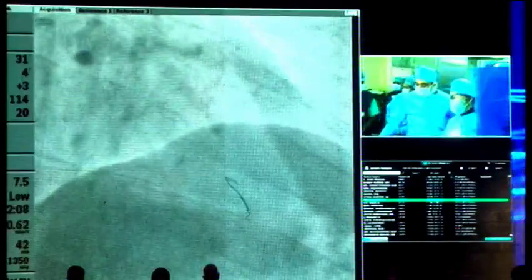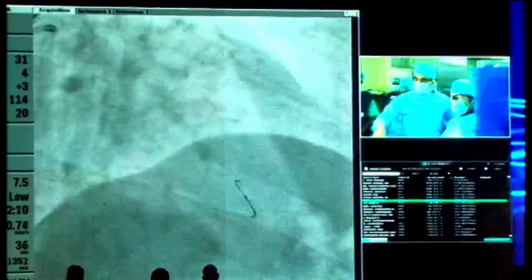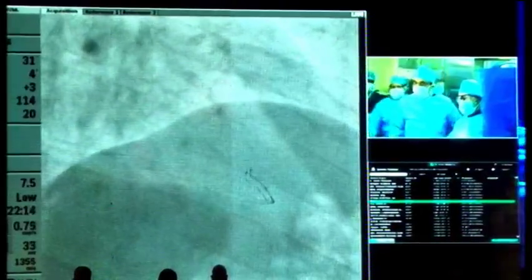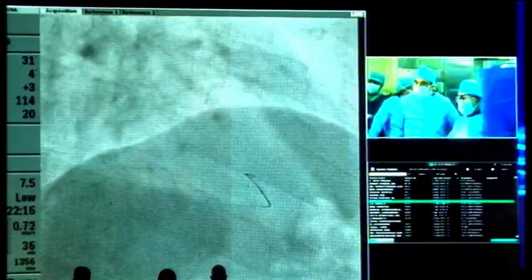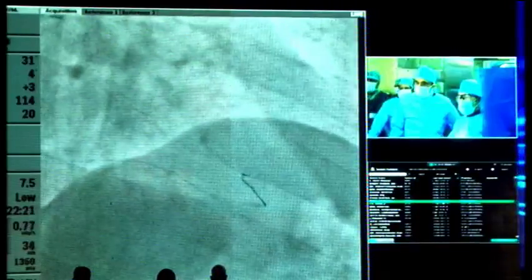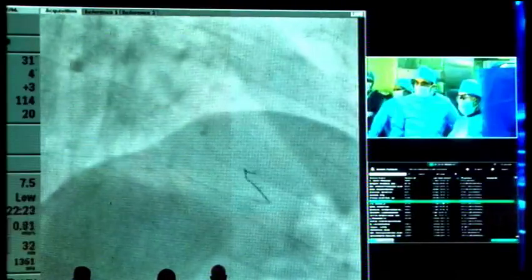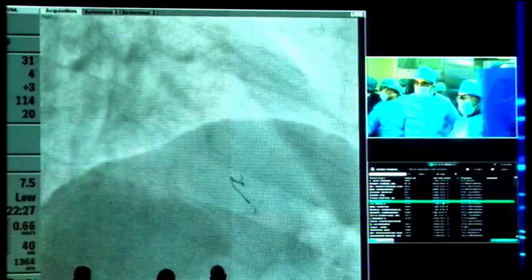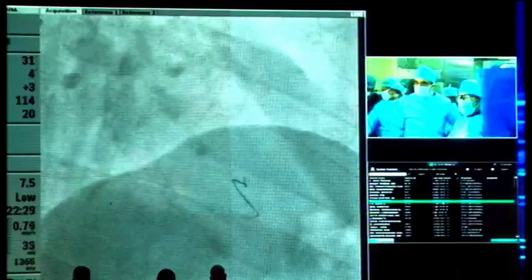But there are several directions. This is one of the branches after this bending portion. So the LAD is supposed to be a little bit more coiling up, not in this direction. Maybe this is the direction. Yeah. This is.